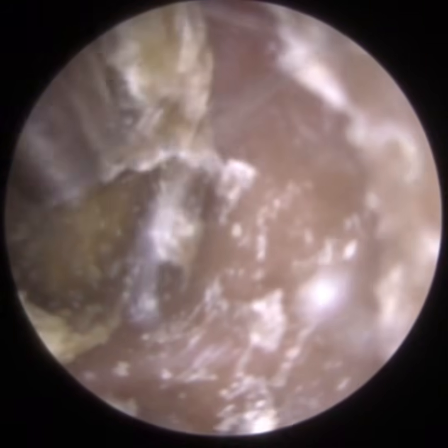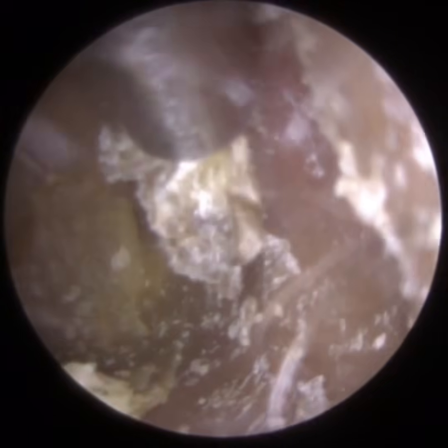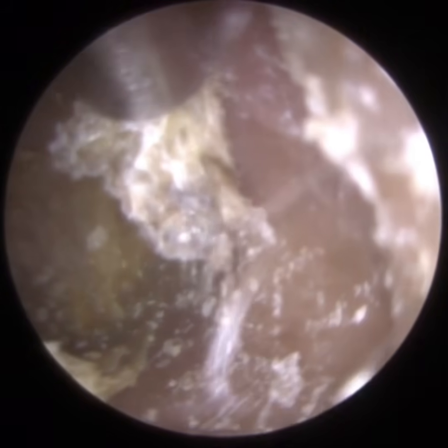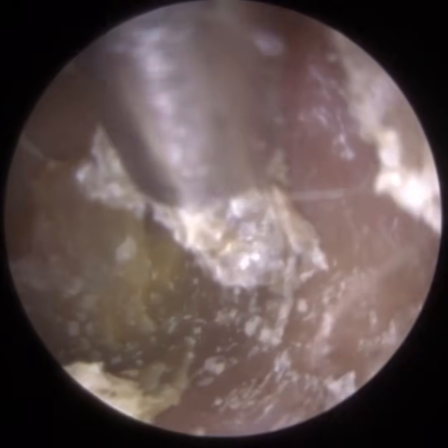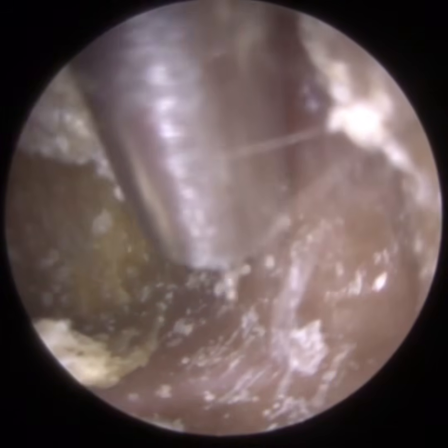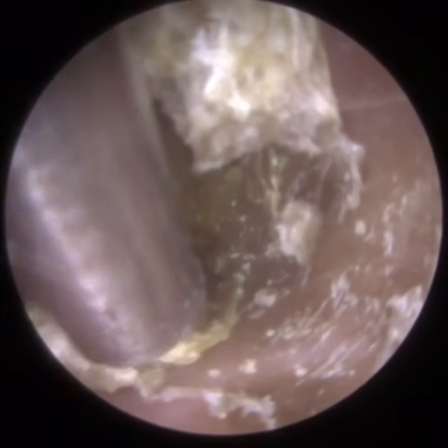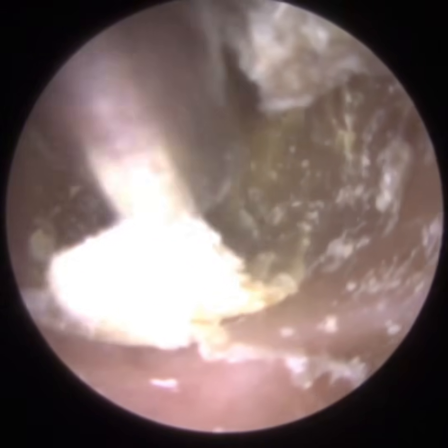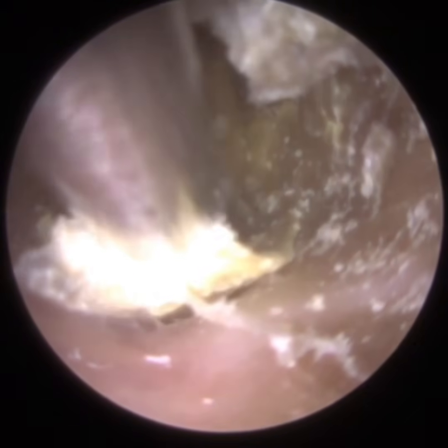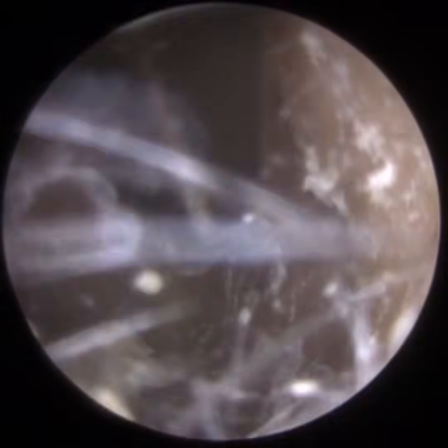What I'm trying to do is lift this dead skin off the canal wall, elevate it, so I've got something to grip onto with the forceps. If this is still on the canal wall, I can't really grip onto anything. And again, because we're on the bony part of the ear canal, we've got to be ever so gentle and cautious because we don't want to make contact with the bony part of the ear canal, because that can be very uncomfortable for the patient. So I think I'm just going to go in with the forceps now.